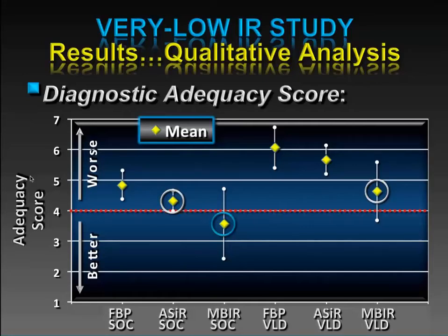Also notice that the standard of care was even better with the MBIR, and this is a suggestion of where to start. If you want to start with MBIR, I'd start with doses that are only slightly lower than you're used to, because I think that's probably a good way to get used to the difference in image quality. However, this isn't the whole story.